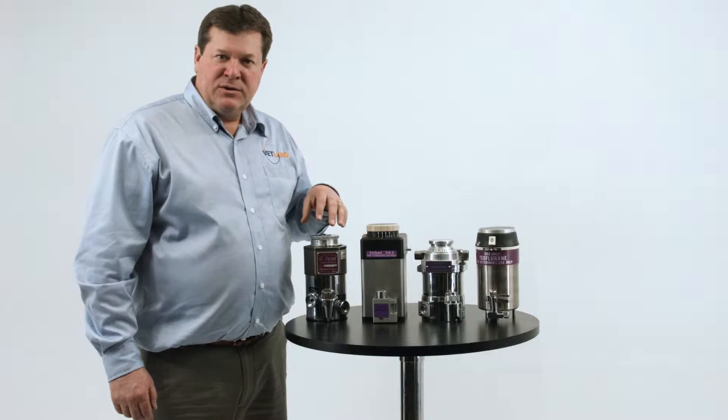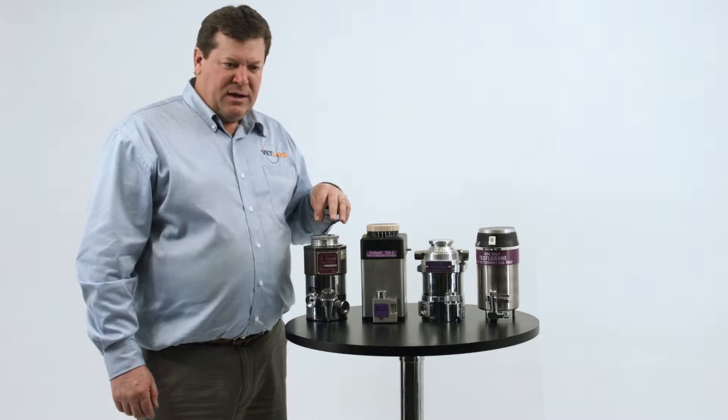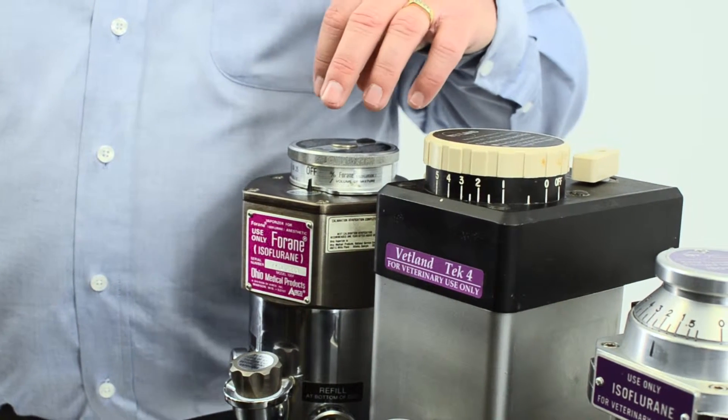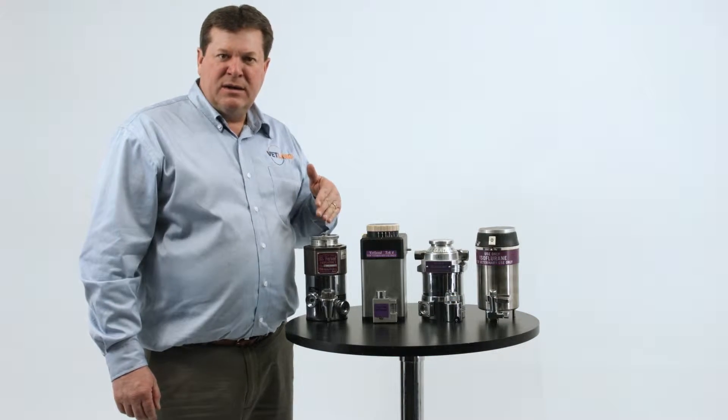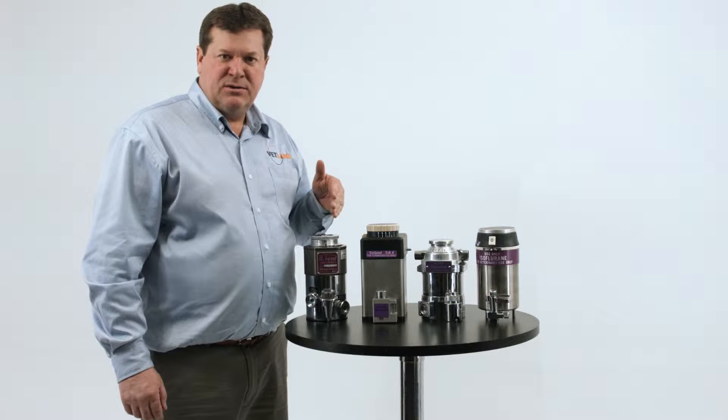The Ohio vaporizer is one of the older designs. It uses a bellows thermostat and paper wick material. It is required to be sent back in every three years and have it adjusted and recalibrated.